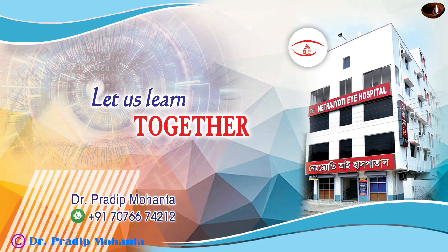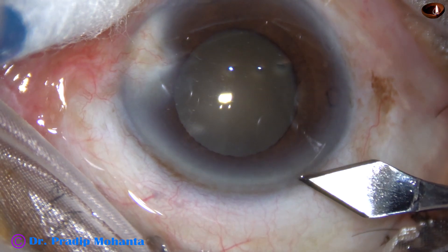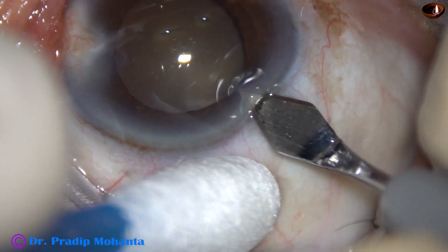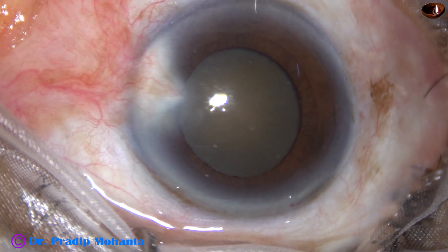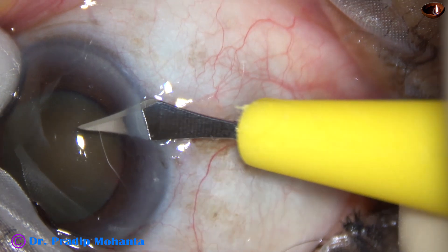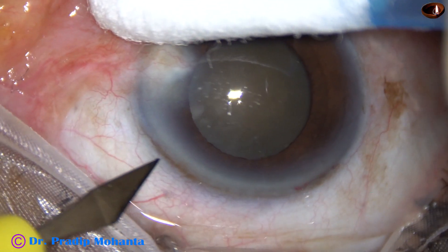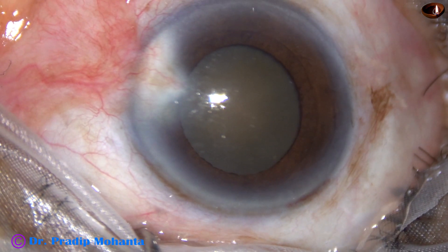Friends, in this video we are going to observe management of a hard cataract with a 5 mm pupil. This is the main incision with the 2.8 mm steel keratome. Two side ports are made — one on the right side, and another on the left side of the main incision.